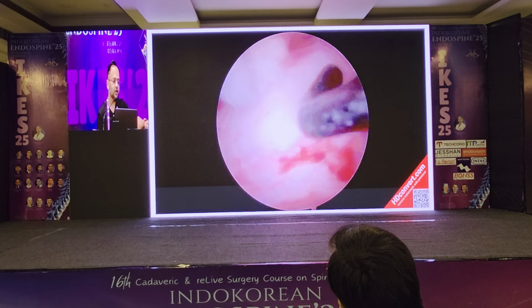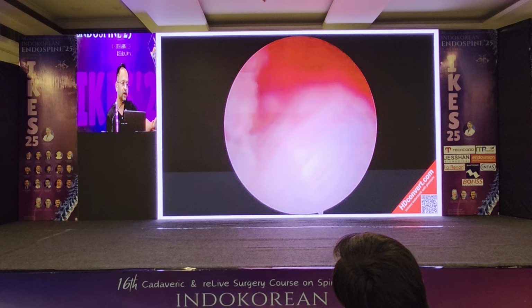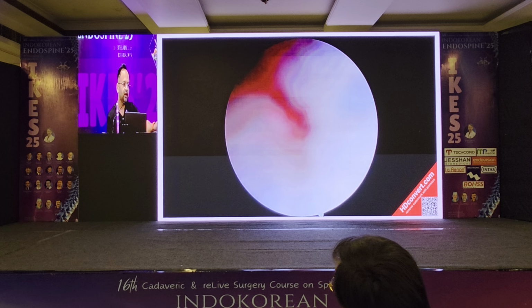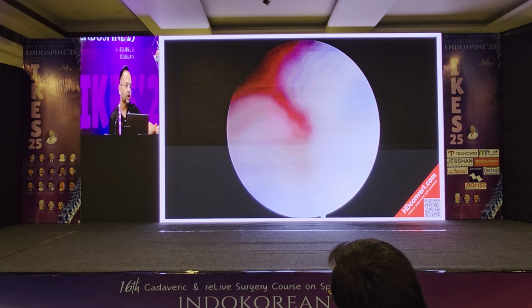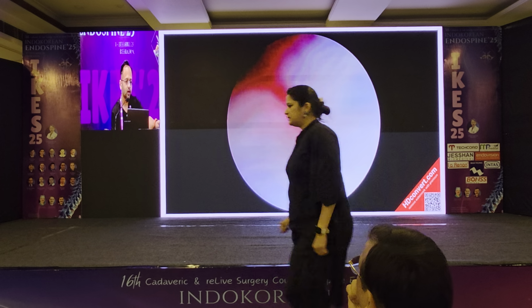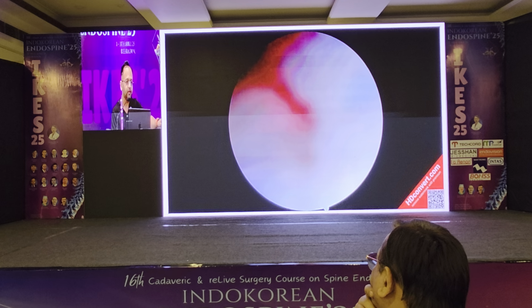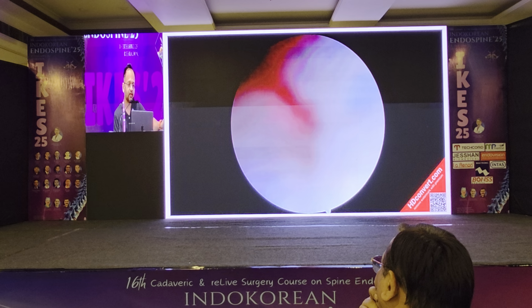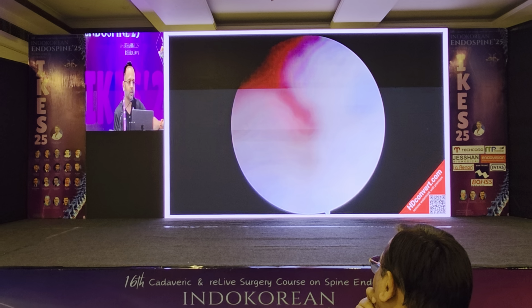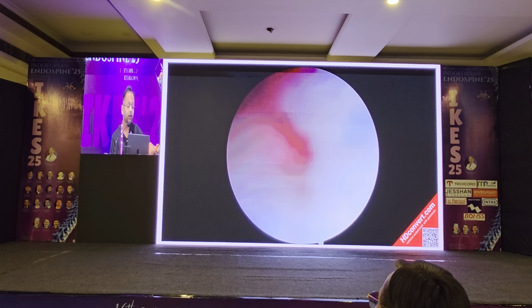So in focal segmental stenosis or 2-level segmental stenosis, I feel endoscopic spine surgery is going to be far ahead. The concept given by the Japanese, that the anterior pathology should be approached from the anterior and posterior from the posterior, is going to change. So people with OPLL still do the anterior corpectomies and anterior release and all this stuff, which is considered to end with dire complications. Posterior cervical decompressions are picking up very well. Posterior laminoplasties, endoscopic laminoplasty is also coming up. So even up to 4-level CVJ, I think we talked in the morning. So most of the cervical pathologies can be well addressed, including the foraminal stenosis.